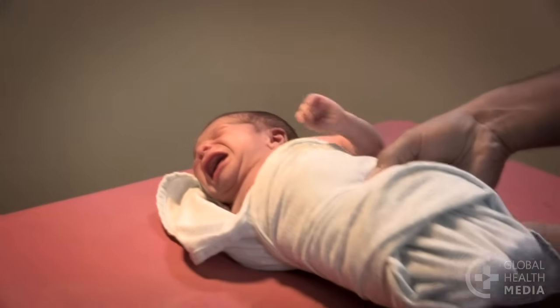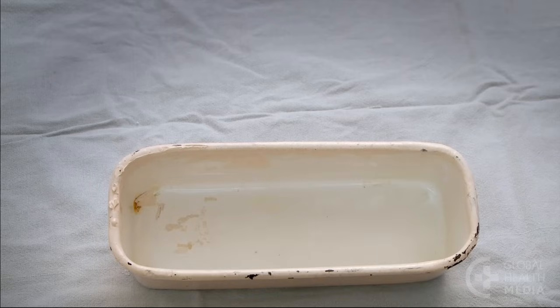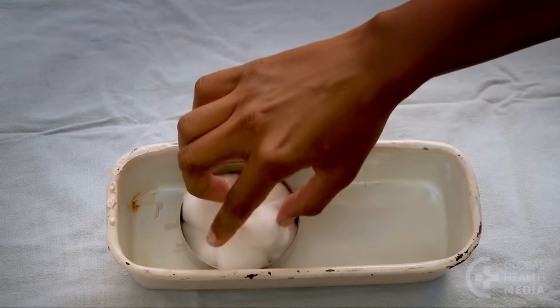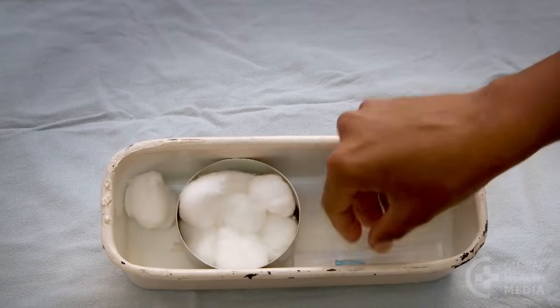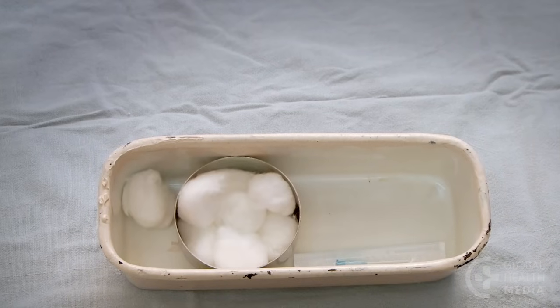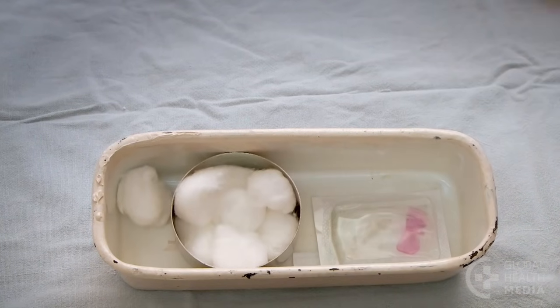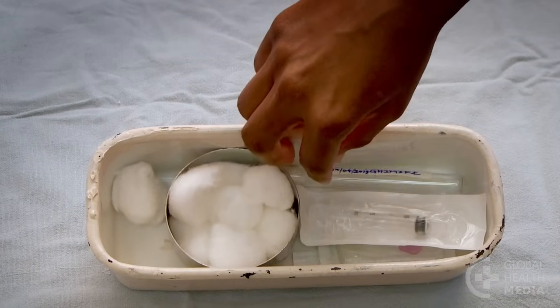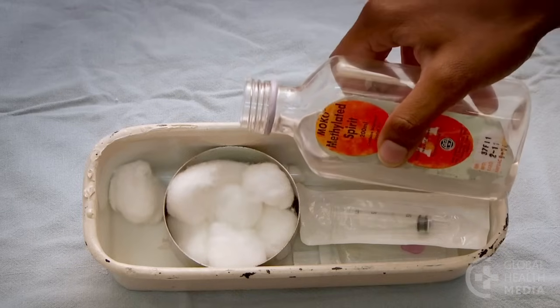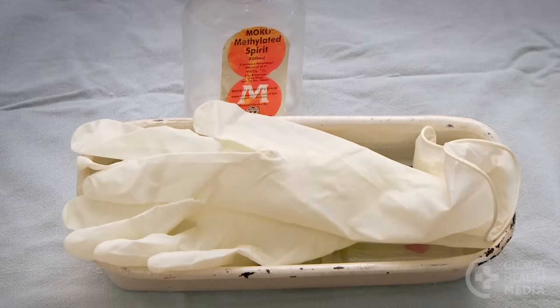Now gather your supplies: cotton balls, either a needle 21 to 23 gauge, a butterfly 23 to 25 gauge, or a syringe and needle. Add a labeled blood tube, pour antiseptic on the cotton, and remember your gloves.